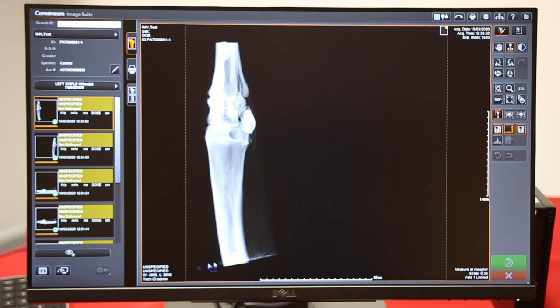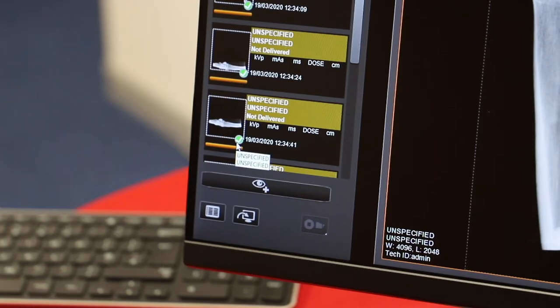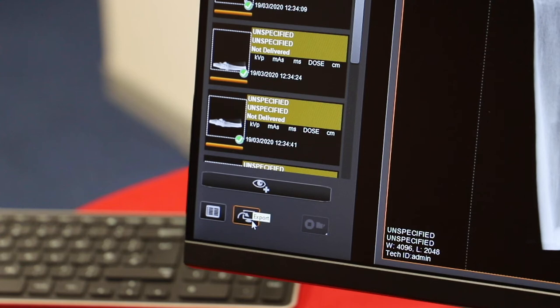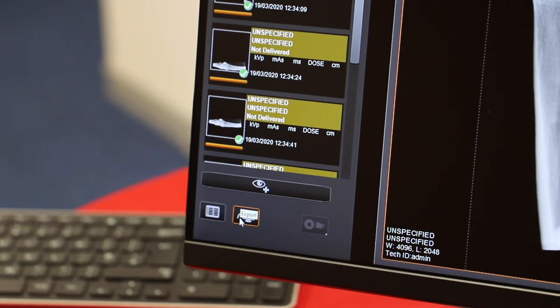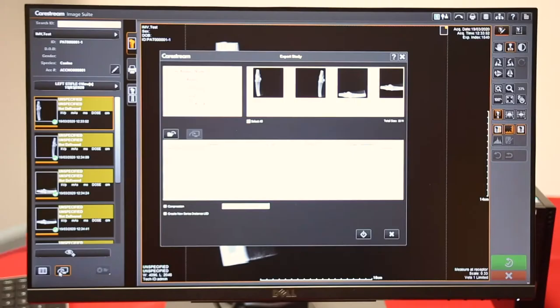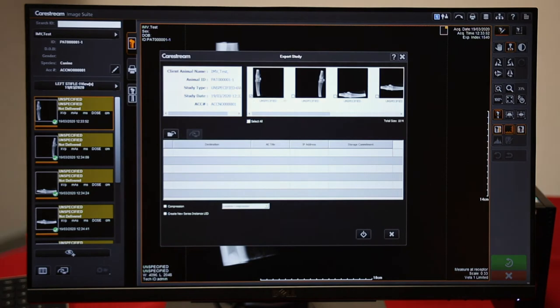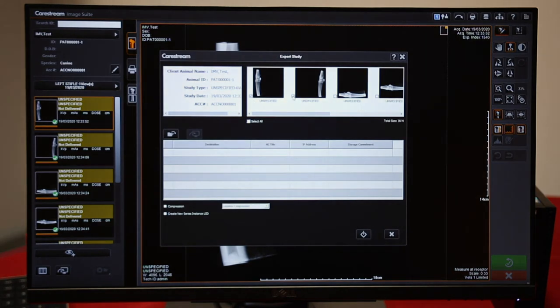To export images, they must first all be accepted before they can be sent anywhere. Here is our export button. Click on the images you want to export, or you can select all.